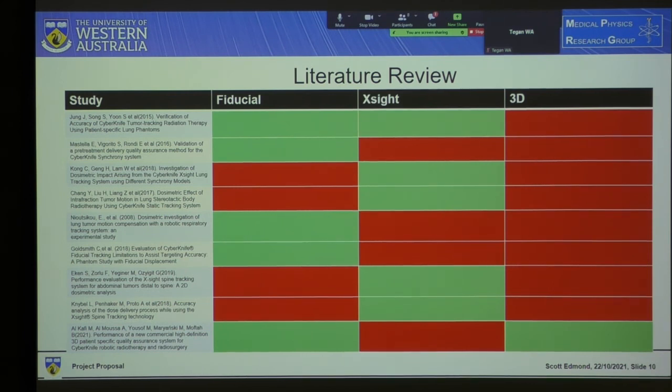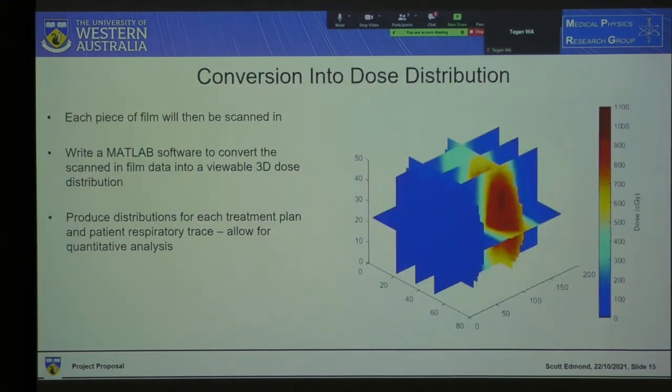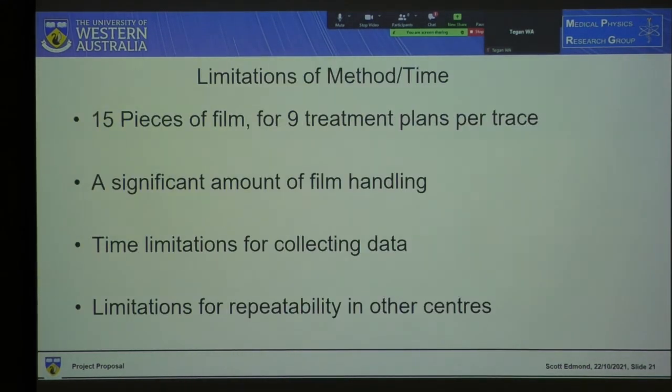Whether I'd account for that in the model, I'm not entirely sure it's applicable considering the breadth of it. We're already doing fiducial markers versus Xsight 1 versus 3 and no view, 1 view, 2 view. Including another parameter of with fiducial displacement or not doubles the number of measurements we need to make. And one of the other limitations of this project is time.